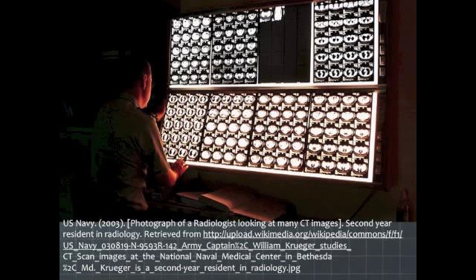So now you have the invention of a whole new field of PACS analysts who are IT personnel trained to deal with the whole computer system that PACS is and keeping it up and running. Because when it crashes, it makes our life pretty hectic. Would you say that it's a general consensus that people like PACS, that they don't miss the film? Nobody misses film. Yeah. Nobody misses film.